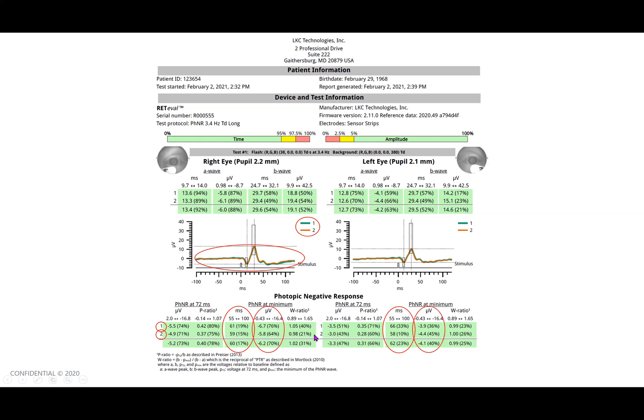Amplitude. Amplitude's a lot more apparent. If amplitude is flagged as yellow or red, that usually indicates this patient has visible glaucoma damage to their eye. You can probably see the damage. If it's green, however, that could indicate there's no damage now, but I would look at this measure over time. Same thing. Snapshot now, look at it six months from now, a year from now. If the amplitudes are getting lower, that could indicate that damage is occurring.